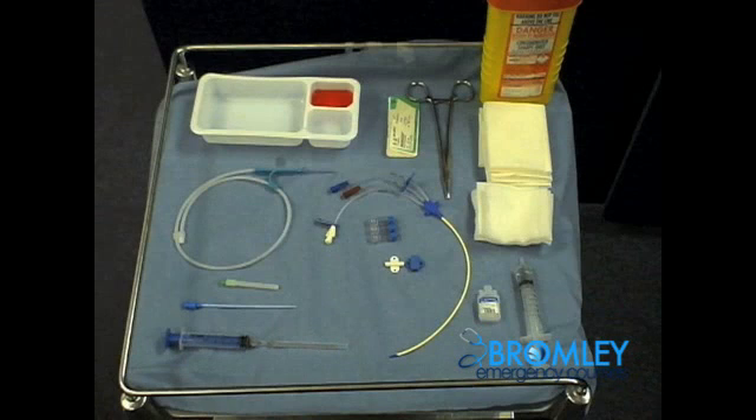This procedure video will take you through the techniques for inserting a femoral line. As this is potentially quite a long procedure, you may be asked in the OSCE examination only to perform a section of this procedure, or maybe even to explain the procedure to a medical student.